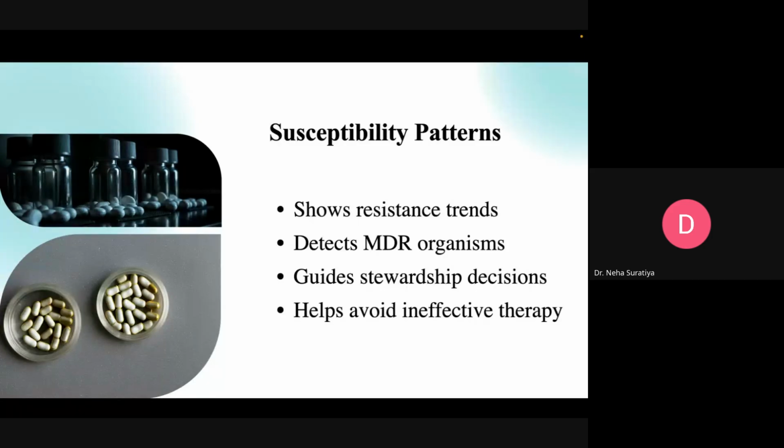It is detecting the multi-drug resistant organisms. We are having lots of organisms in the healthcare which are now MDR. We have three different terms, guys: MDR, XDR, and PDR. So MDR means multi-drug resistance. Name itself has meaning. Many drugs will be resistant.